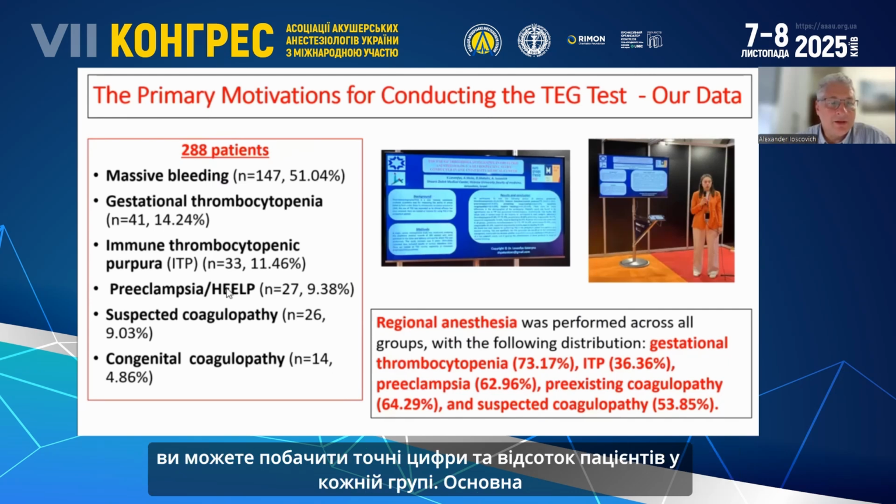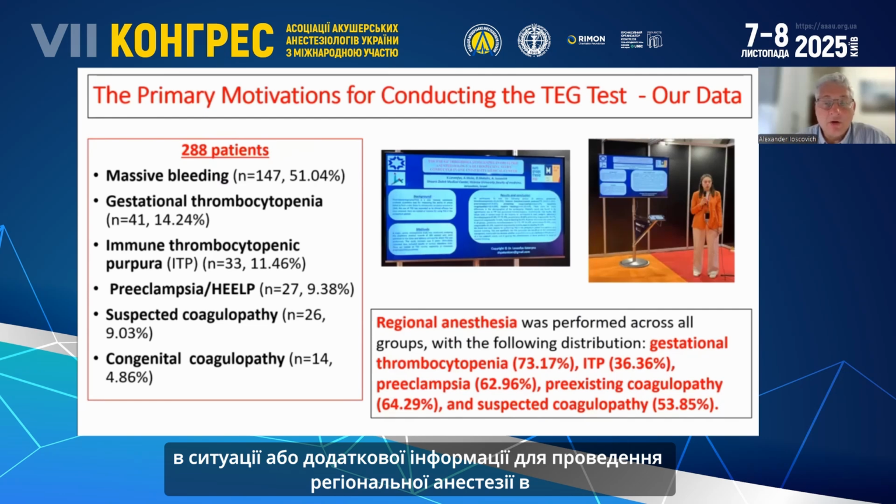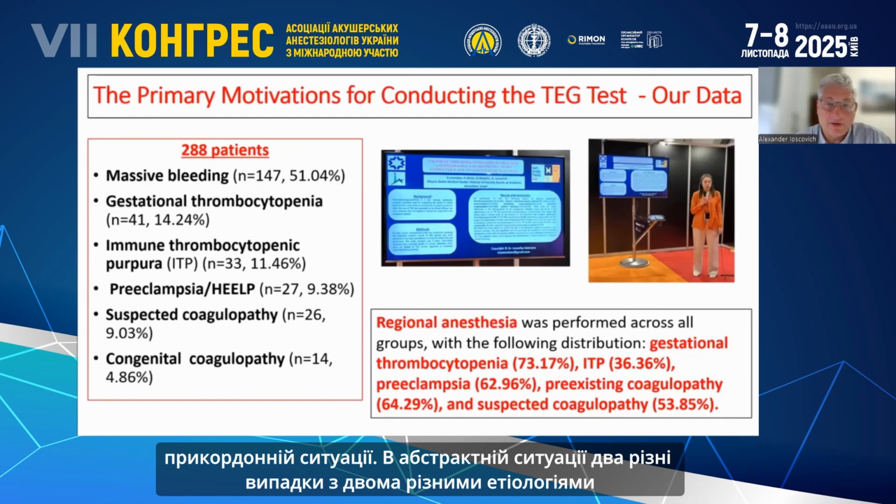Here you can see the exact numbers and percentages of patients in each group. The primary motivation for conducting the TEG test was TEG-guided coagulopathy treatment, usually in an emergency situation, or additional information for performing regional anesthesia in a borderline situation.